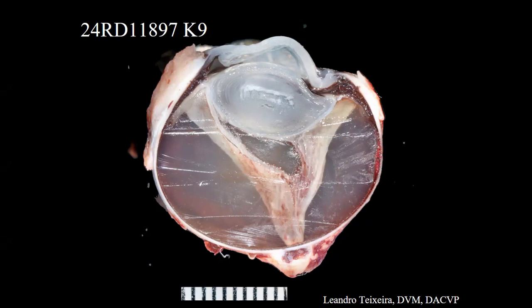The history is very extensive, and I will try to summarize. There's lots going on here. We will talk about the history later, because otherwise it will give away too quick. It was enucleated because of mainly glaucoma, and they suspect a complete retinal detachment and vitreal degeneration.